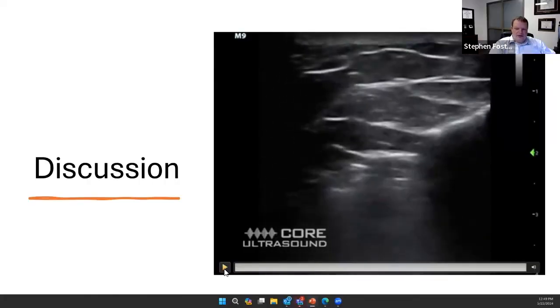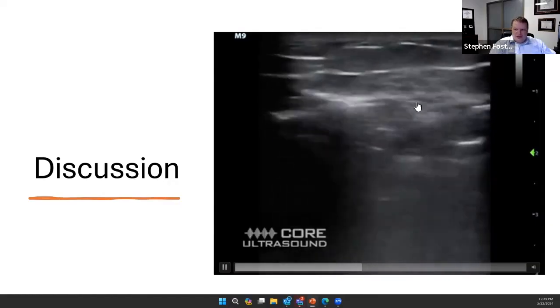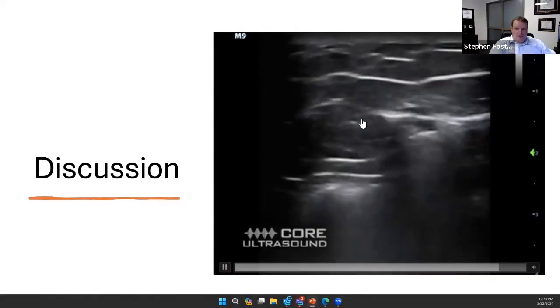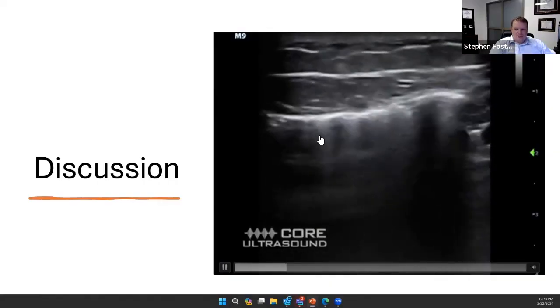But one of the first lessons I learned in performing ultrasound is that if the image looks bad, there's probably air interfering. So if you notice up here how there's a bunch of interference, and there's some black pockets, and there's just a bunch of scattered light, that is all emphysema, or air trapped underneath the skin, that's causing interference with the ultrasound.